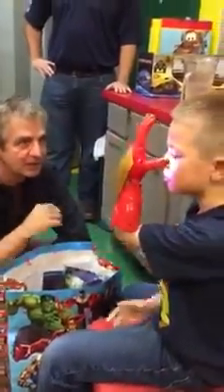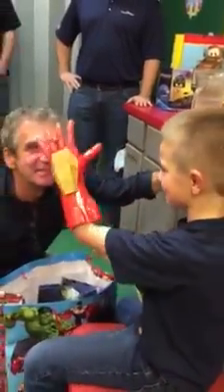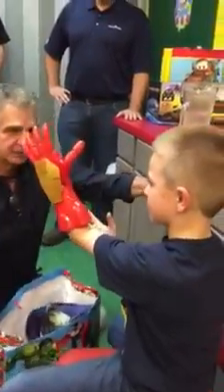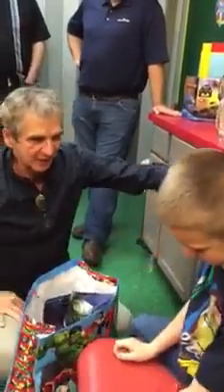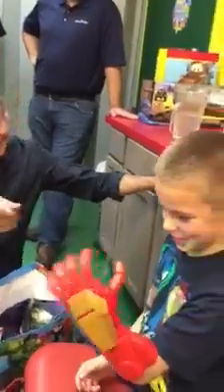You can make the hand close, you can make it work. Colorful, right? It's colorful. Look, it's light. It's going to be like a robot. Shine your light on. You know when your mom drops the keys in the driveway and it's dark? You could light up the driveway and help your mom find her keys. I love it. Isn't that awesome, buddy?